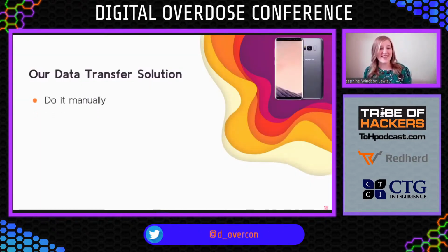Our data transfer solution, for example, is to just do it manually. We're just not sending it over the internet. We are keeping these phones 100% offline. All of the data is localized and not even connected to the internet. And we take the data manually back to a hospital and transfer it there. Great short-term solution, not a feasible long-term solution.